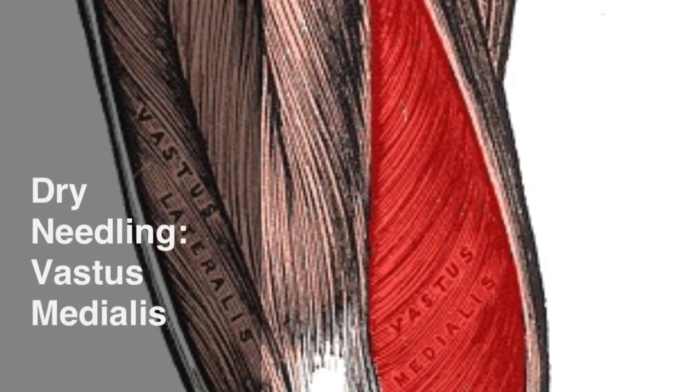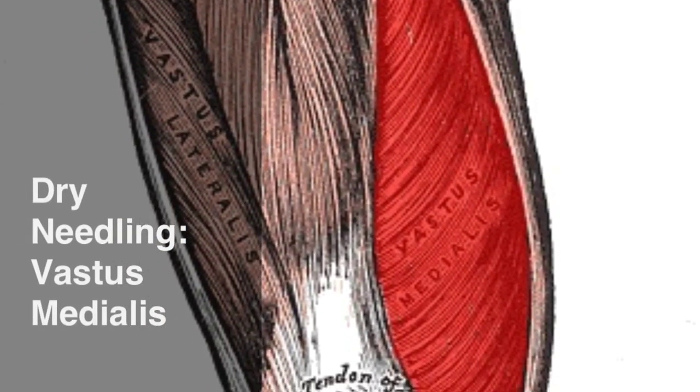This video looks at the dry needling technique for the medial quadriceps muscle, the vastus medialis.